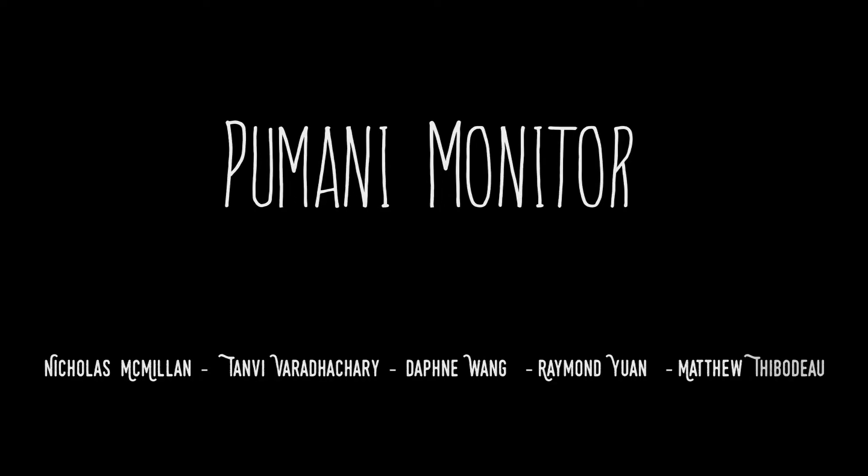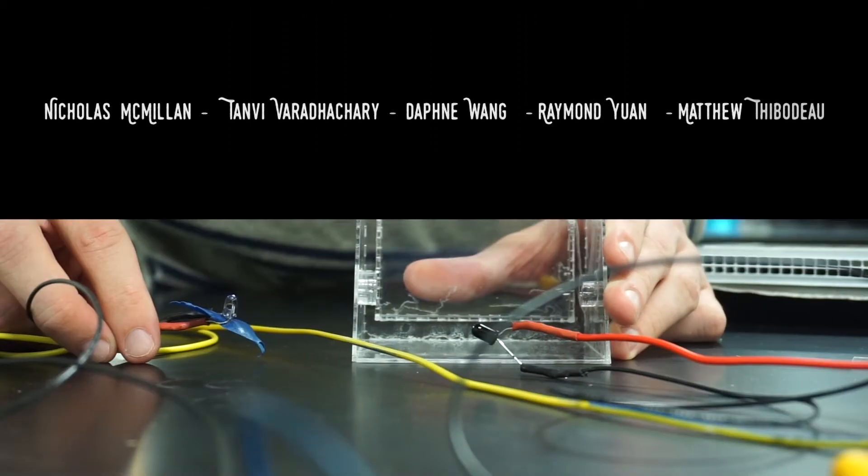The Pumani system monitor is composed of three parts: the LED photodiode component, the alarm, and the stand.